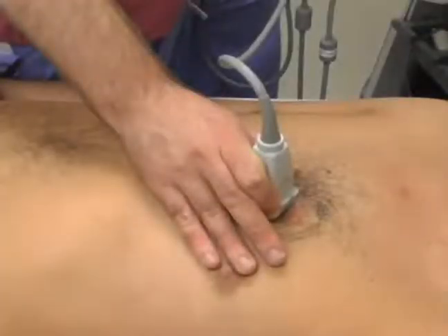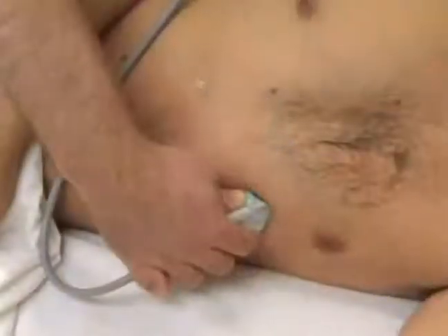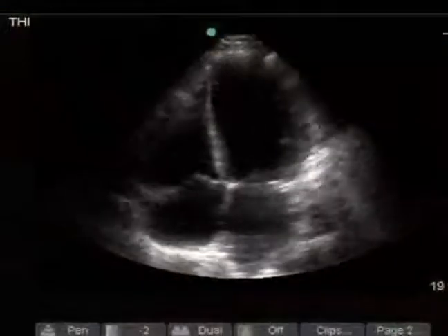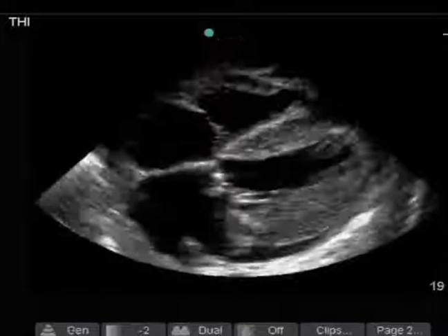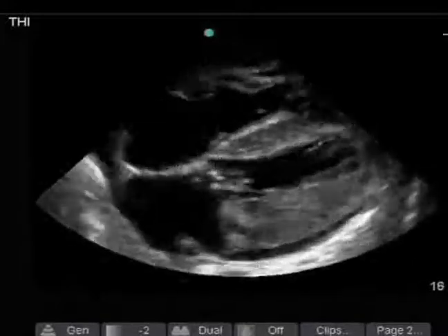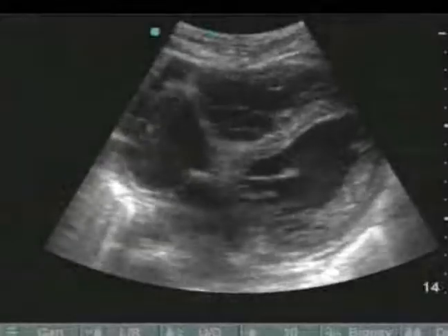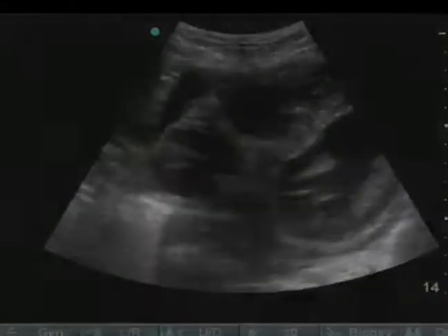Recognize the limitations of ED echo. Valvular function, segmental wall motion abnormalities, and detailed description of cardiac function are beyond the scope of this application. The limited ED echo is not a substitute for comprehensive echocardiography. Be aware that anterior fat pads and pleural effusions may be mistaken for pericardial effusions. Sonographic assessment of cardiac activity may be helpful in the management of pulseless patients.